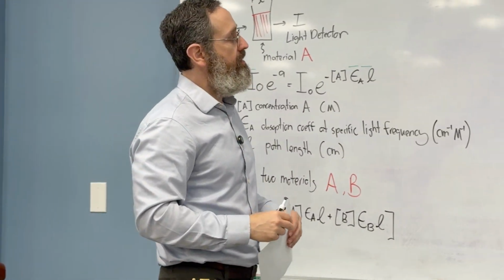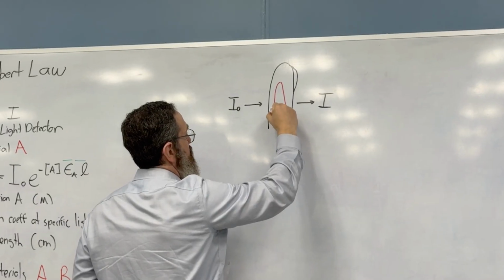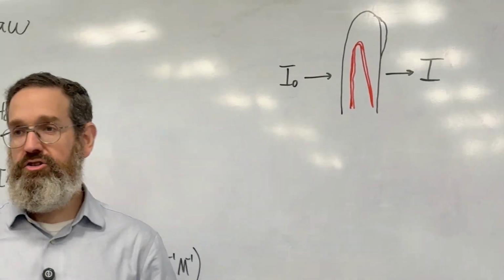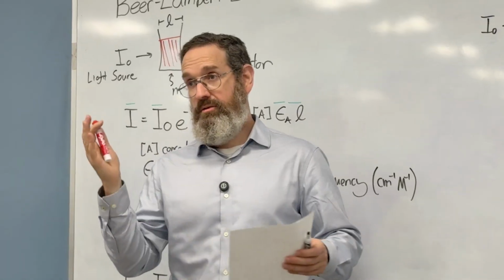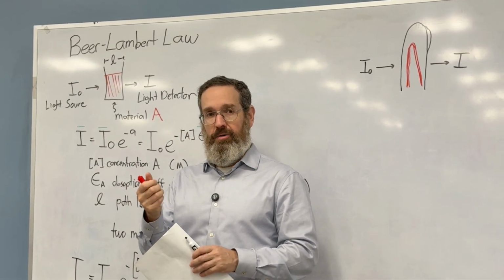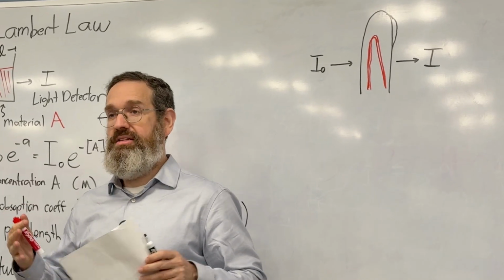Now, it turns out that there's two, and so there's blood in here. You know, from your physiology class, very important that blood picks up oxygen from our lungs and delivers it to all our organs, or we die very quickly. There's two ways the blood can do that. One is it can sort of dissolve the oxygen inside the blood, like bubbles in a soda, where you open it up and the bubbles are kind of inside of it. It turns out that that's not very efficient because it can't absorb that much oxygen.